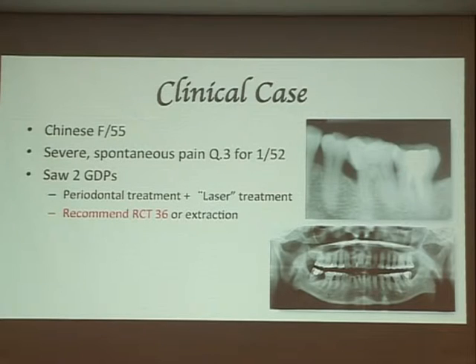In this case, I do pulp testing, TTP of it. The tooth is all normal except a little bit sensitive, but you can explain that by the exposed teeth. So, is the pain caused by 37? That's been done for many years. I don't think it causes spontaneous pain in this case because there's no nerve inside.